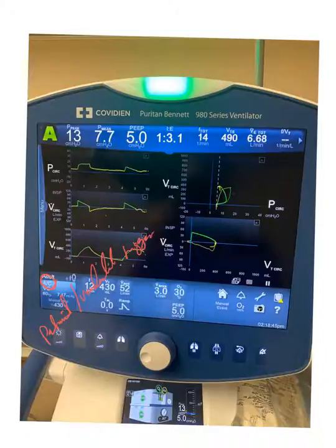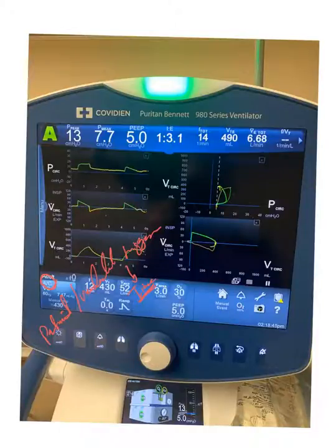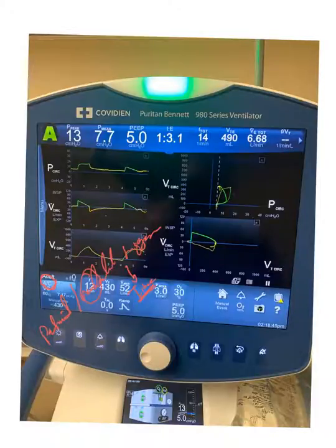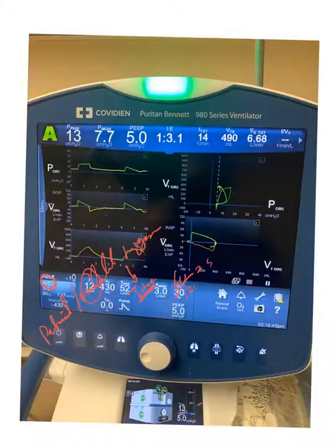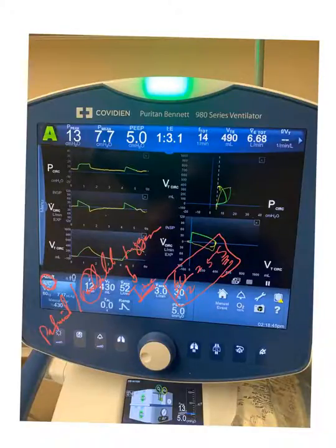The ventilator trigger is always time. Here you can see 12 per minute, so simply every 60 divided by 12 — which means every five seconds — the ventilator will deliver a breath if there is none initiated by the patient.